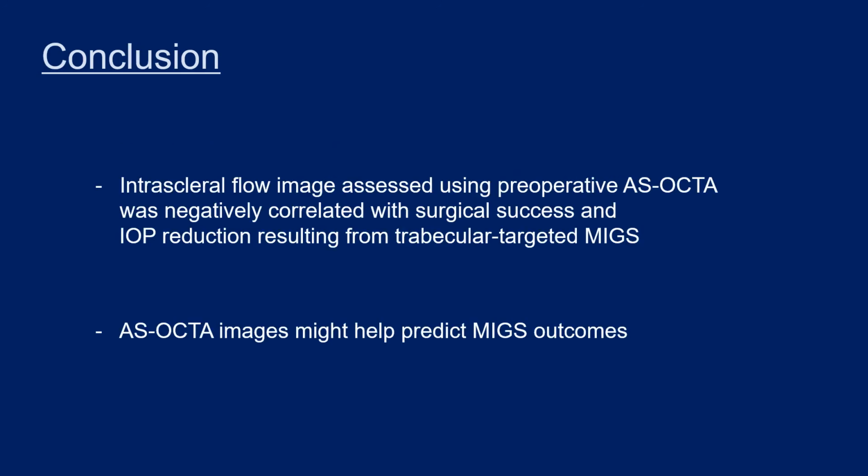Intrascleral flow image assessed using preoperative OCTA was negatively correlated with surgical success and IOP reduction resulting from trabecular-targeted MIGS. OCTA images might help predict MIGS outcomes.